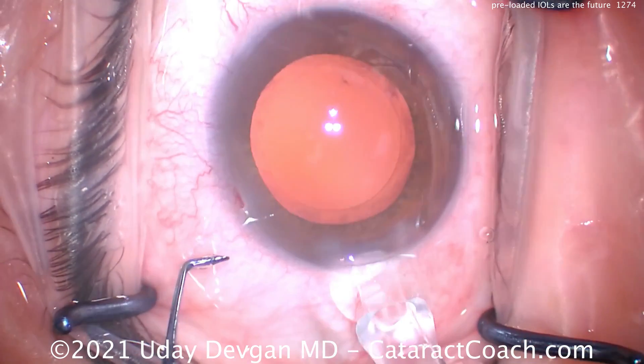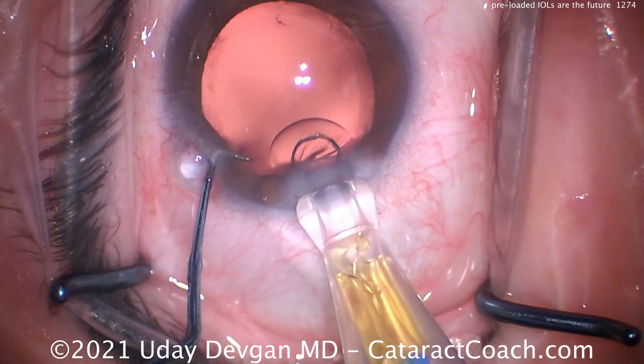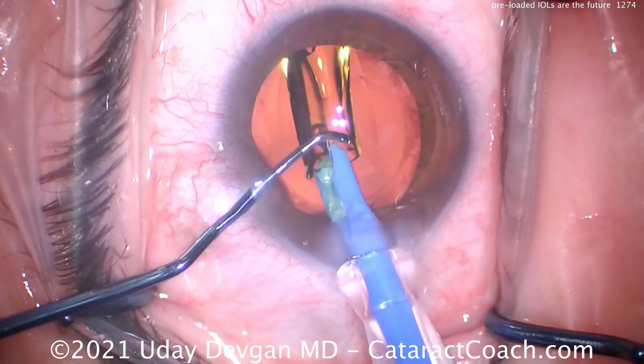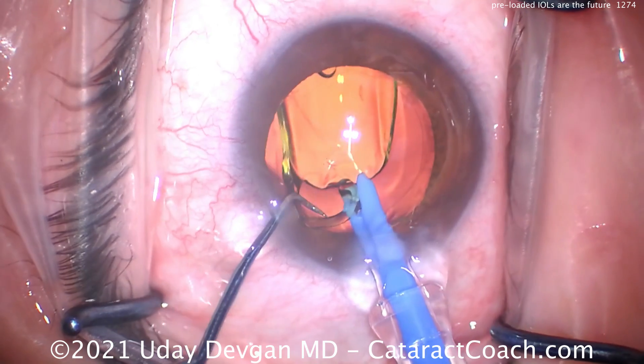Injector tip going in — we can start to deliver it outside the eye a little bit to get the lens moving down. You can see the cohesive viscoelastic versus the dispersive in the eye. There comes the lens in the capsular bag, and now the chopper with the other hand can help get that into the capsular bag.